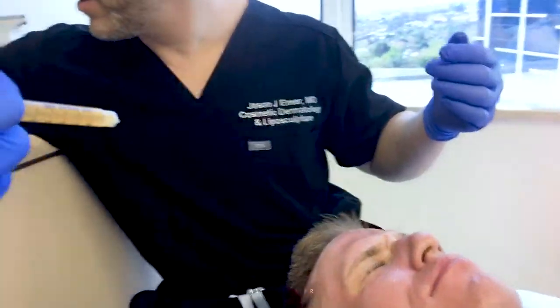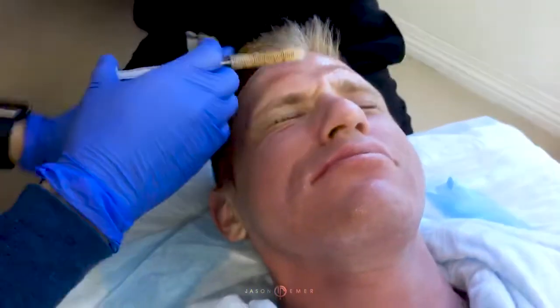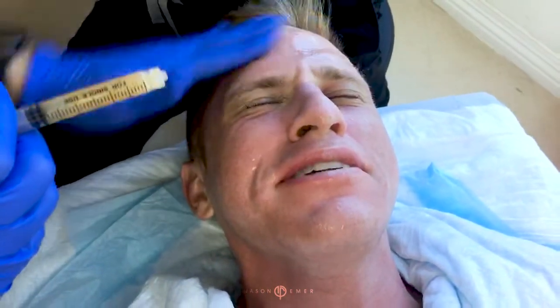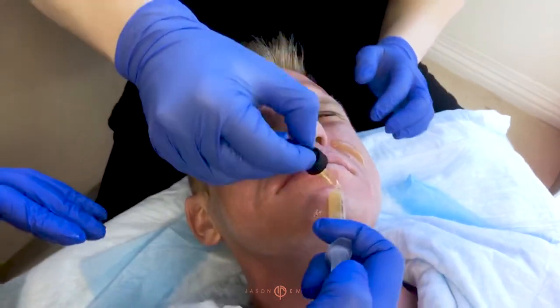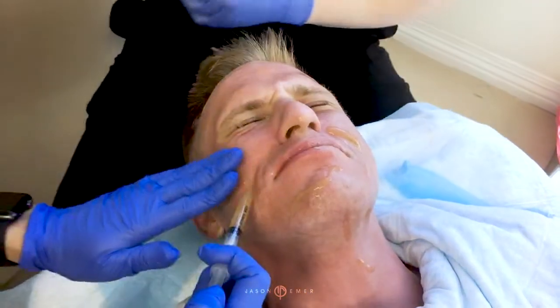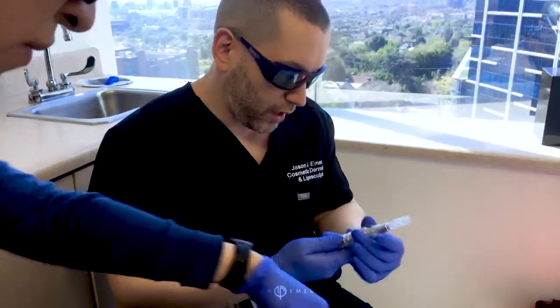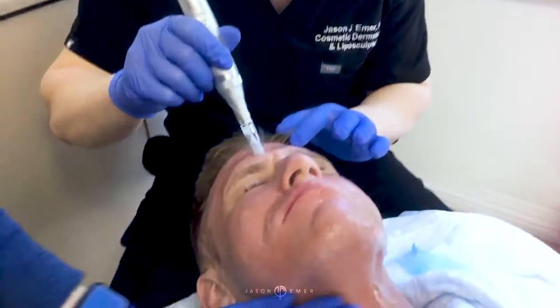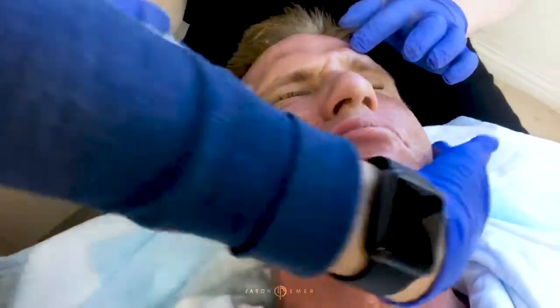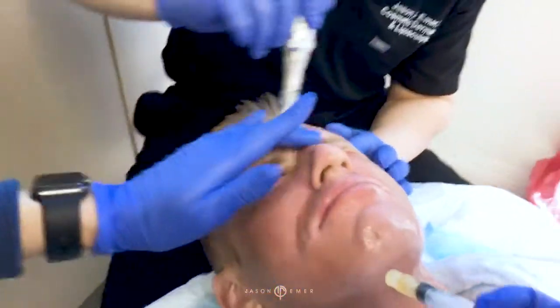You can go ahead and put those on. I'll do that in a second. You put that on. Is my face numb enough for the microneedling? Yeah, you'll be fine. I'm gonna do it light. I'll put a little bit of vitamin C on with the stem cell. And the needling, which we're gonna do just light enough to push in through the skin. Now he already has columns of energy that have been placed in the skin to help us, I won't go crazy, to push the stem cells into the skin, which will 1, help him heal, but 2, make his skin look better, and 3, help prevent, in my opinion, sun damage related skin cancers.